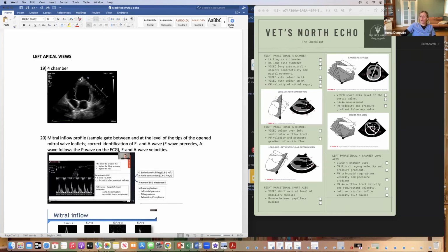And if you think about the angle that your probe needs to be on to look up through the heart like that, you're not going to be perpendicular to the chest, are you? Because you get cross-sectional views if you're perpendicular. You've got to be end on, looking up through the heart. So it's a really awkward one to get. If your heart is looking a bit sideways, it's because your probe is on the side of the ventricle rather than at the apex of the ventricle, and you need to move further back.